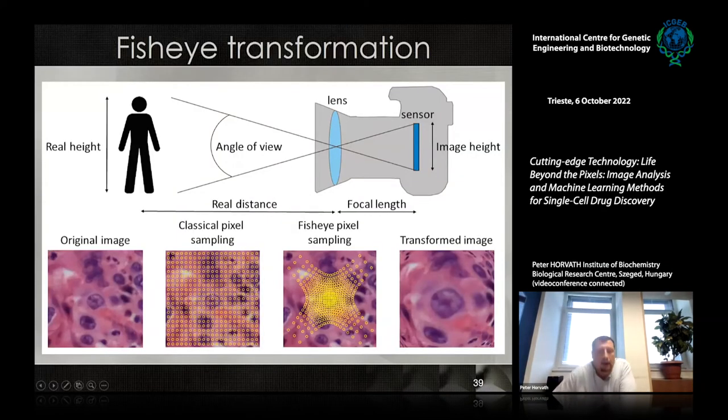Most recently, we were thinking about whether it is somehow possible to incorporate this into a deep learning method. I was sitting a couple of nights with pathologists to see what they are doing. They pick a sample, they look at 5x, 10x, 40x, different magnifications, look by eye, and try to make the conclusion and the diagnosis based on looking at the different scales. So I thought, could we somehow incorporate that into one picture? And we started to think about a method which can indeed do that.